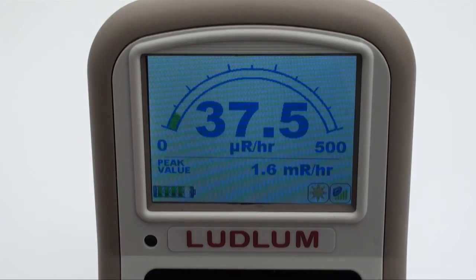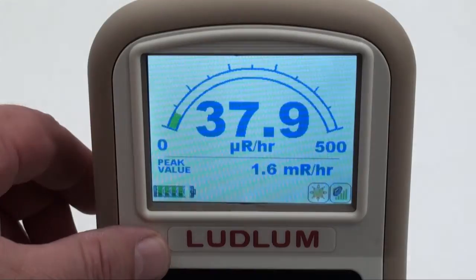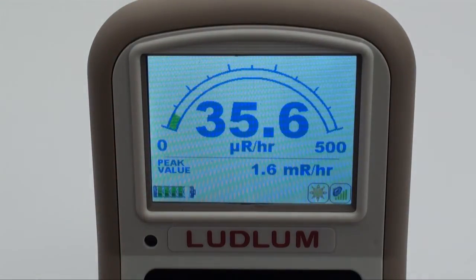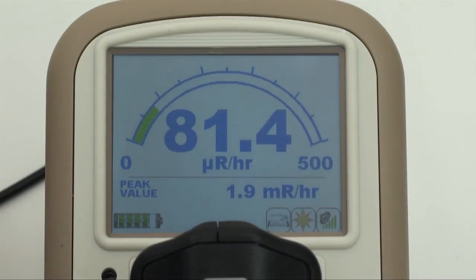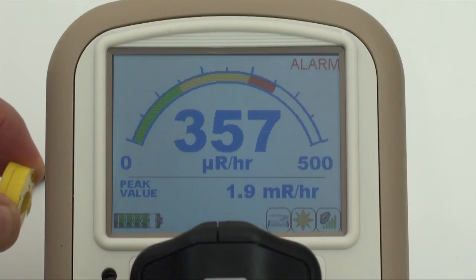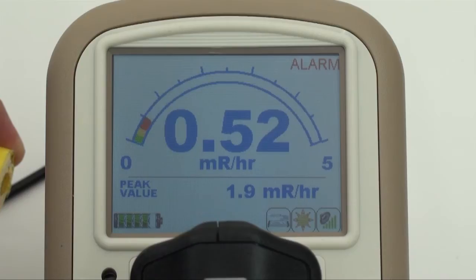The readout is displayed on a sunlight-readable color LCD that automatically adjusts the backlighting for ambient conditions. The bitmap color display and fast processor facilitates an easy-to-read, auto-ranging graphical display accompanied by large numerical readouts and displays two separate measurements simultaneously.